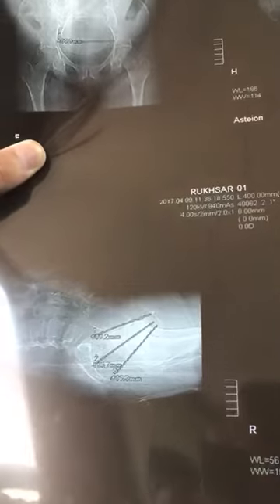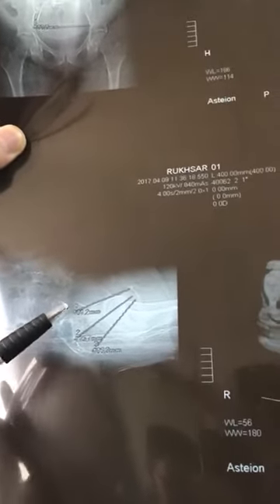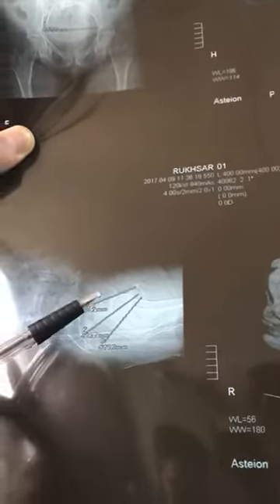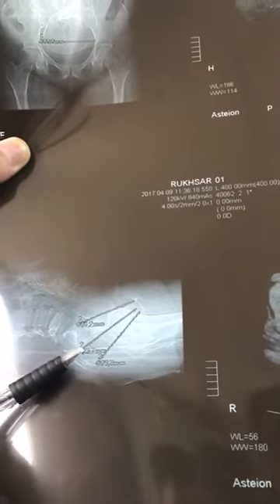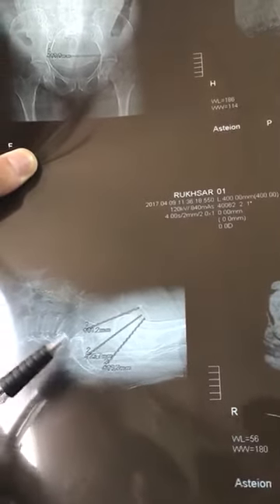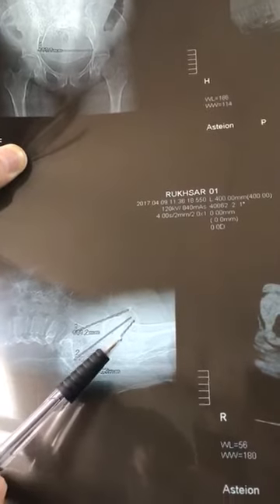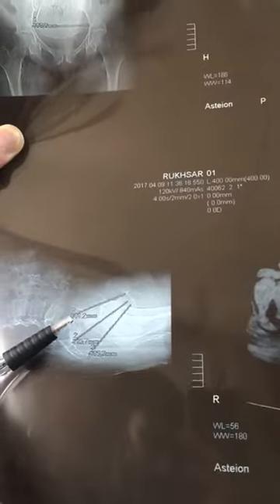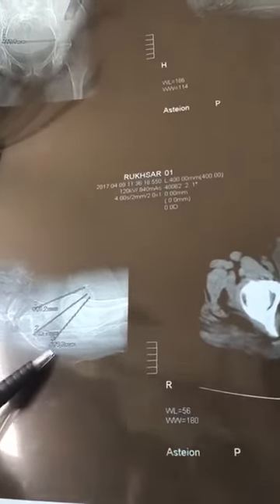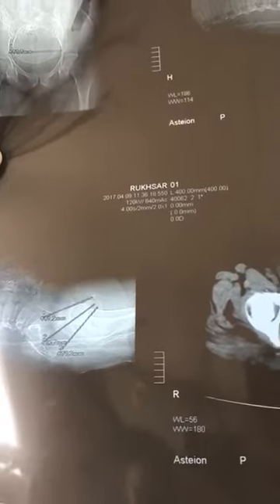This is also the lateral view. Here we look for the anterior-posterior diameter of the pelvic inlet, the diameter of the pelvic cavity, and the anterior-posterior diameter of the pelvic outlet. These measure 10.1 cm, 10.6 cm, and 11.5 cm respectively in this CT pelvimetry.